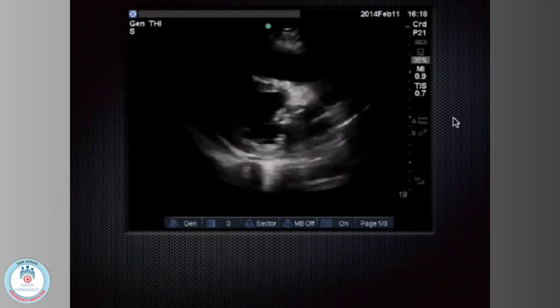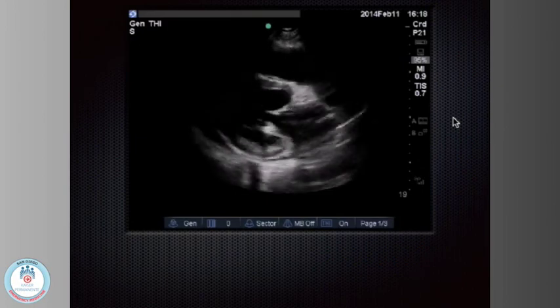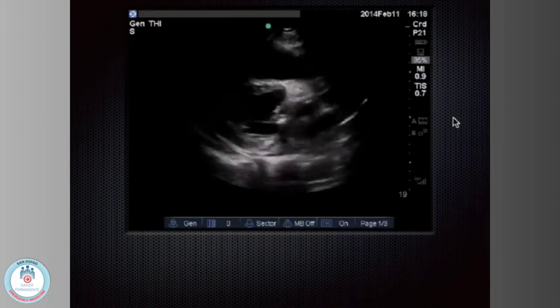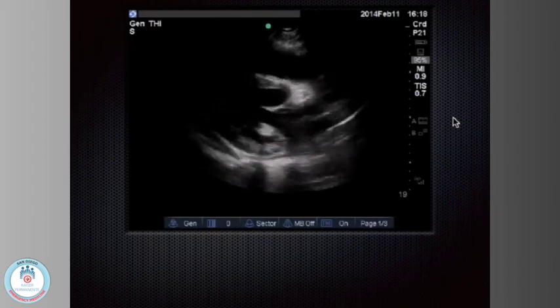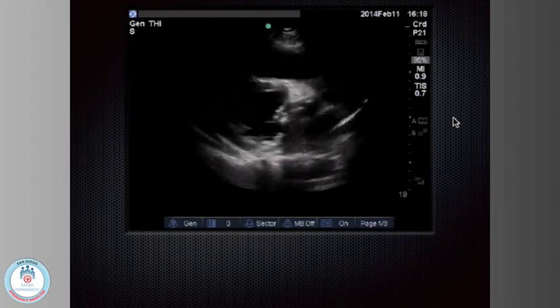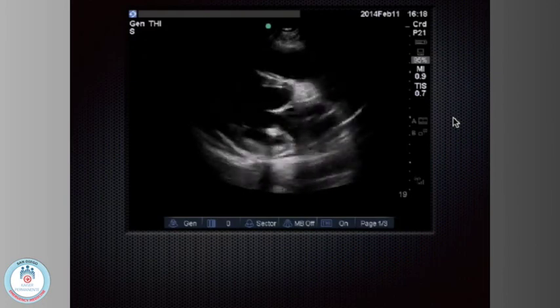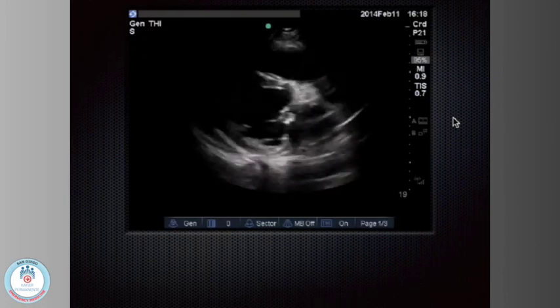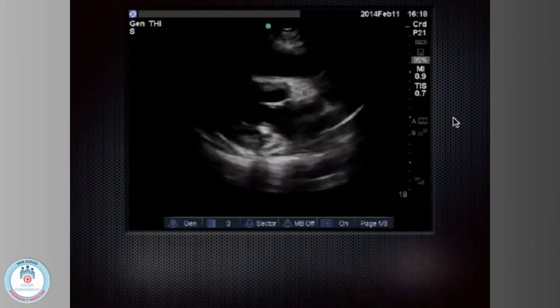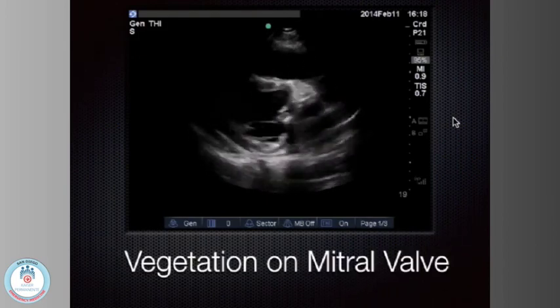And what's this diagnosis? What view of the heart is that? Parasternal long, yeah. What do we have? Is that an emboli or a thrombus on the valve? Yeah, it's a big veggie on that valve there, on that posterior leaflet of that mitral valve. There's a big vegetation there.